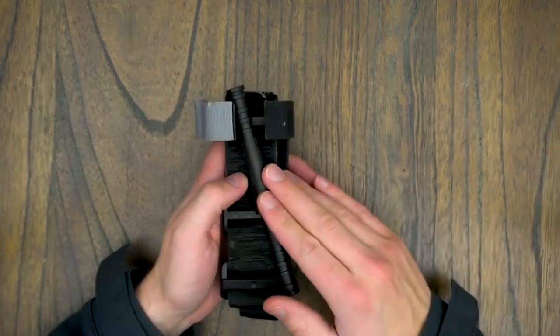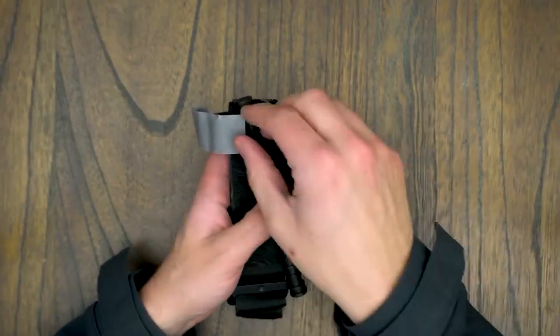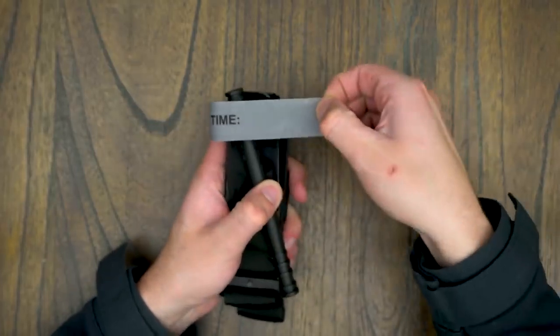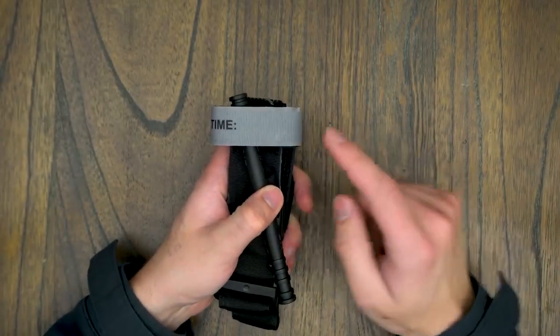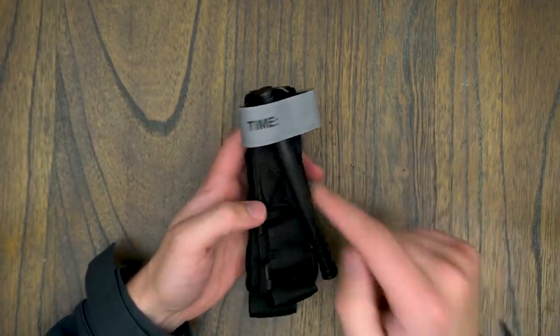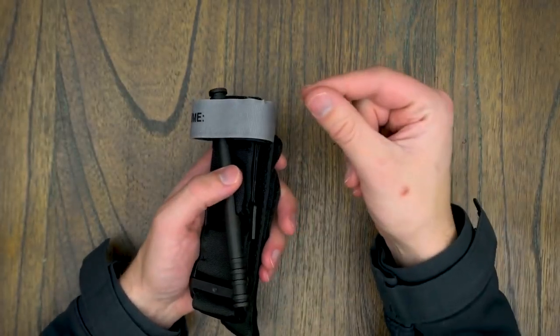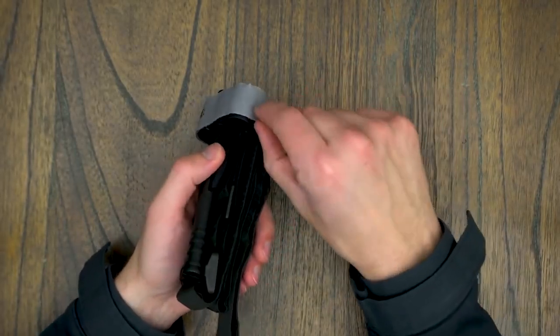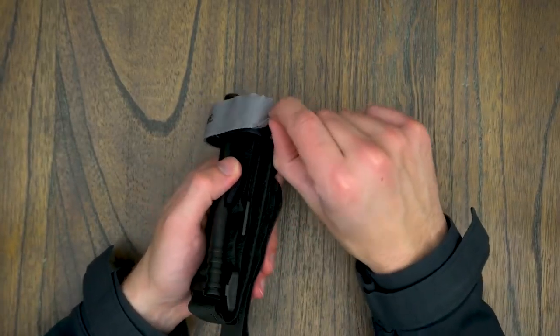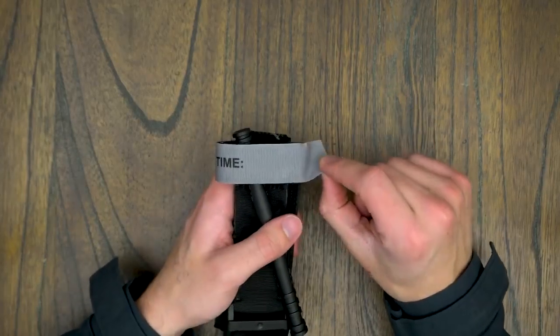The second most common mistake I see, and I think a problem that's a pretty big deal, is having the time strip of your tourniquet deployed over your windlass. This is a big problem because the first thing you lose when you're under stress, and I guarantee you if you're applying a CAT tourniquet, you are under stress, is your fine motor skills. And trying to grab this tab right here and peel it off Velcro with just your two fingers, that is the definition of a fine motor skill.